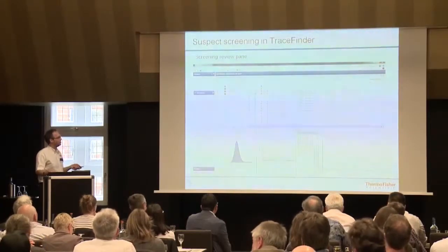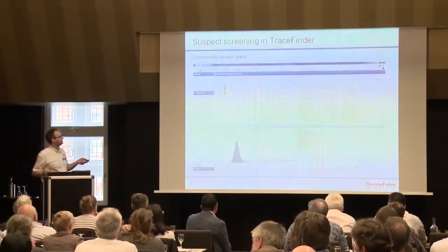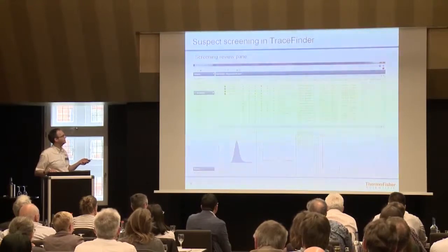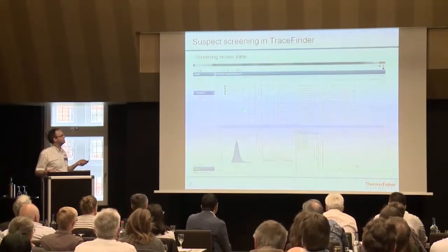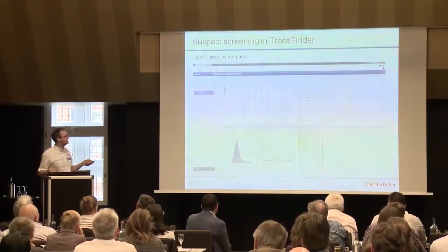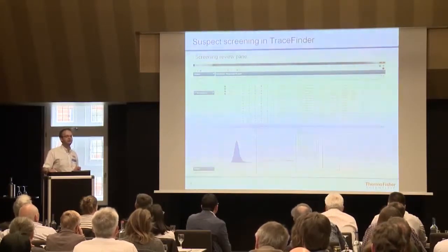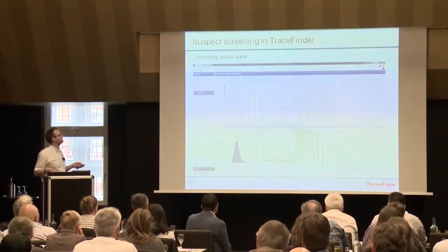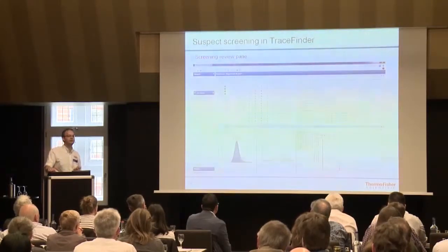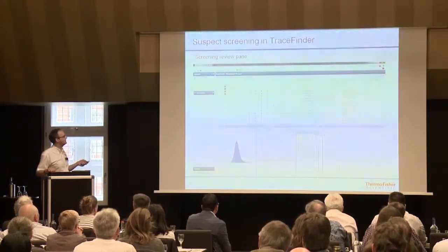The review later on will look like that. So you get lots of colorful dots. In this case, you see green and red ones. We have yellow there as well. What does it stand for? So we have basically the occurrence of a peak. I mean, without that green dot, it wouldn't occur here at all, because the extracted ion chromatogram shows a peak. Second is the ion ratio of the fragments we can take into account. We can take into account the isotopic pattern match.